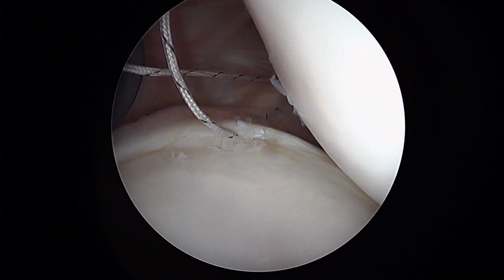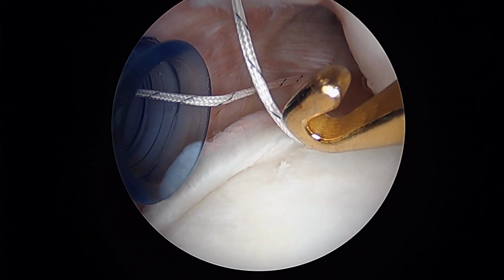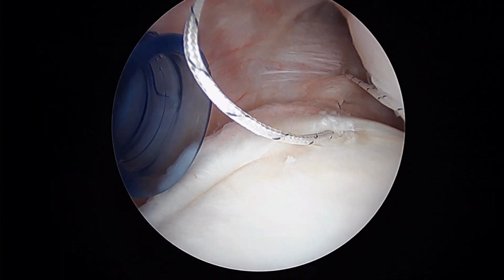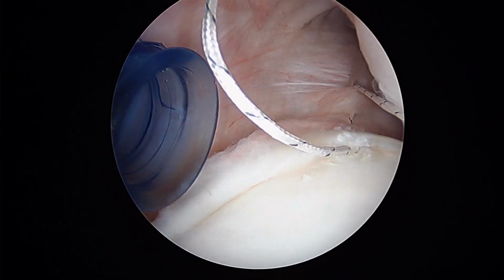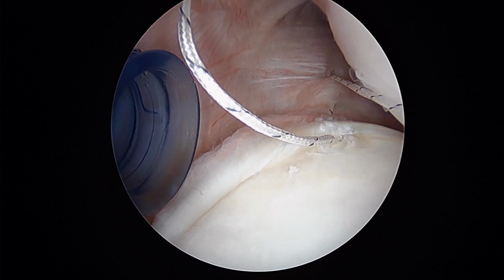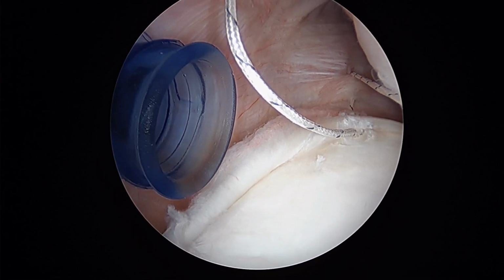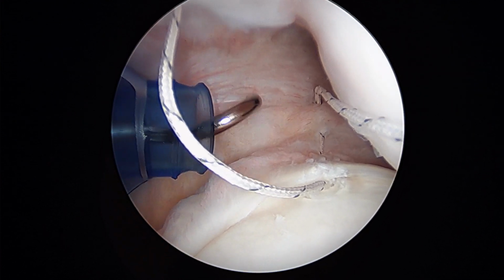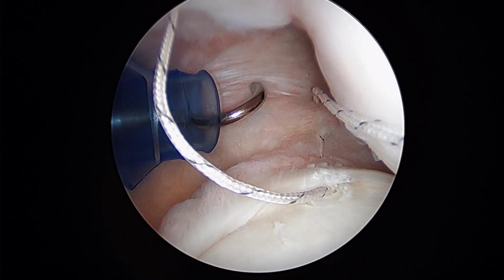So we're going to reach in from the front and use this same suture one more time. We're going to repeat the exact same process. Grasper in the front. So now we're going to start here. We're going to make sure we have good space.